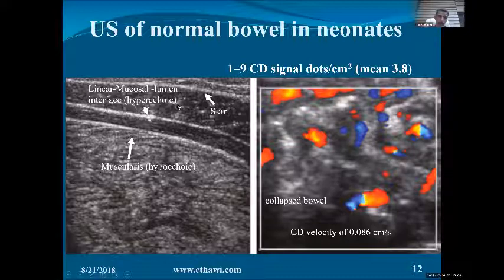So this is the lumen. You can see the wall, and then the hypoechoic area, and then you'll see the muscularis area. So this is the wall of a bowel, okay? It's very magnified. So if you're lucky, you can see 3 layers: hyperechoic, hypoechoic, hyperechoic. You cannot see all 5.